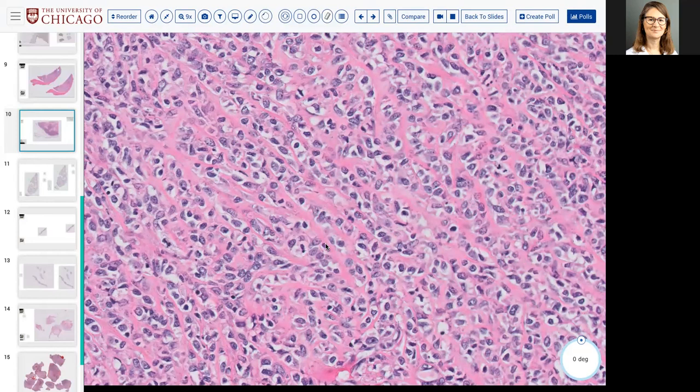Okay, Ryan, MUC4. Why MUC4? I mean, this is the perfect field for single filing between these sclerotic cords, so like a sclerosing epithelioid fibrosarcoma. You got it.